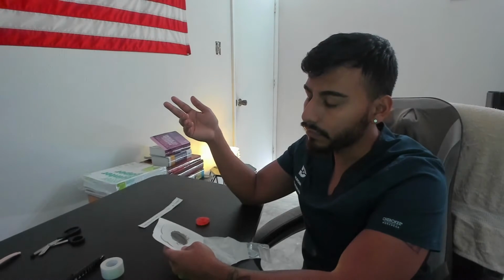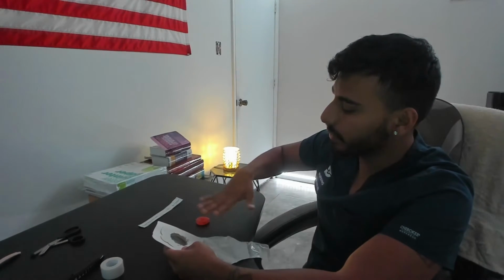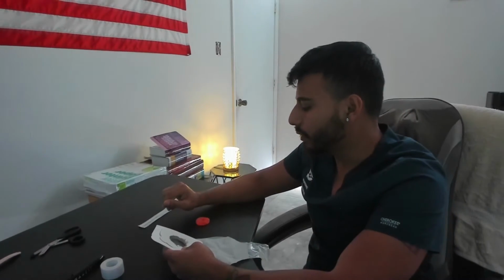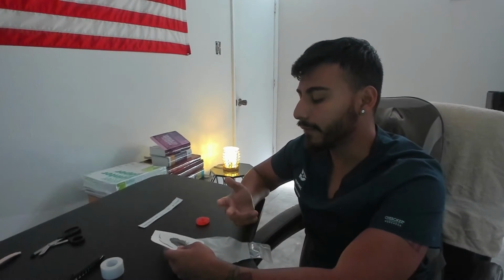I would use warm water and a cloth to clean the area, and I would pat dry with the towel. I would not use pre-moistened cloths. While I'm cleaning it, I would place a gauze over the stoma if it is draining continuously. After I finish cleaning the stoma, I remove my gloves and perform hand hygiene.